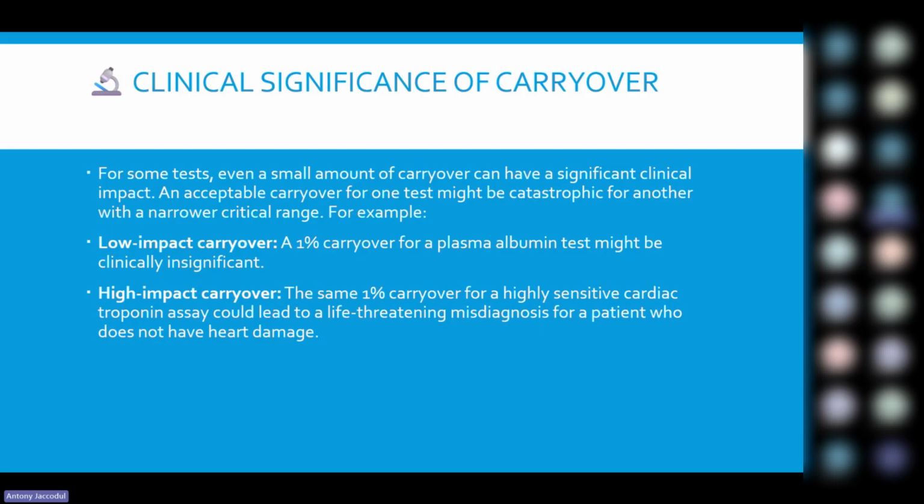And when treatment is applied that is not appropriate for that particular patient, you might even lose the patient in the long run. So it is very important that these particular tests, especially the high sensitive tests, are checked for carryover as much as you're doing for others.